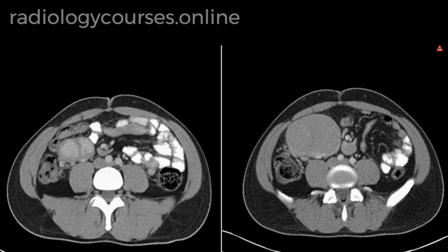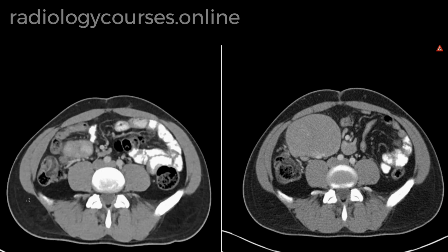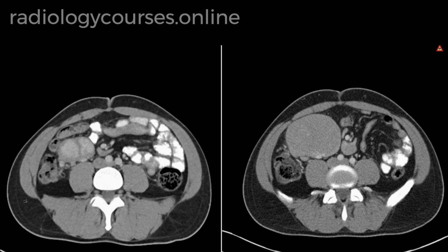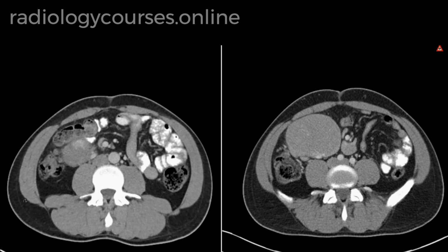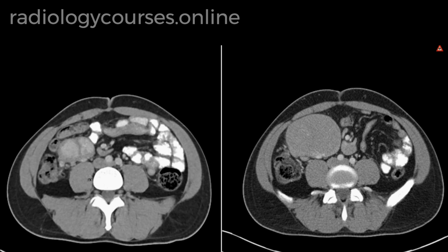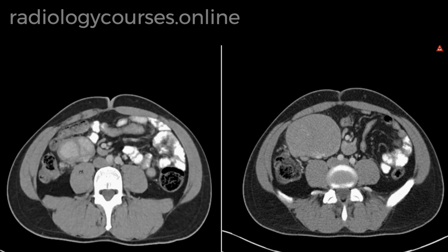It may be due to vascular occlusion in the lymph node, especially if the patient has got radiotherapy rather than chemotherapy. So these are the few causes I found on search of literature on the internet, but I did not find any papers which are looking into multiple cases of lymph nodes which show increased density or enhancement during the course of chemotherapy.